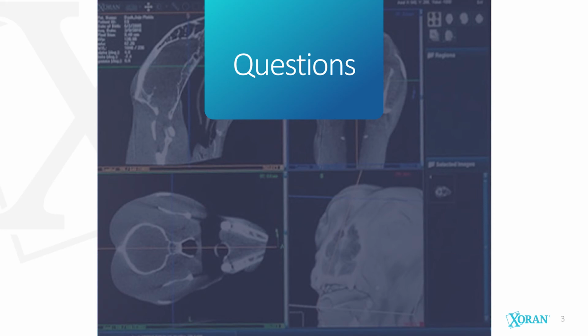So I guess it's a matter of where you'd want to put it in your practice. I think maybe that's what Lorraine's asking. You know, do you have to have walls in between or whatever? I know Chris Bannon has got hers just sitting on the floor, and she rolls it up to the animal before they start the dentistry and takes a cone beam. So it's not in a particular room like you have to have your other big x-ray. I don't know if that answers your question, but just check with your local authorities.